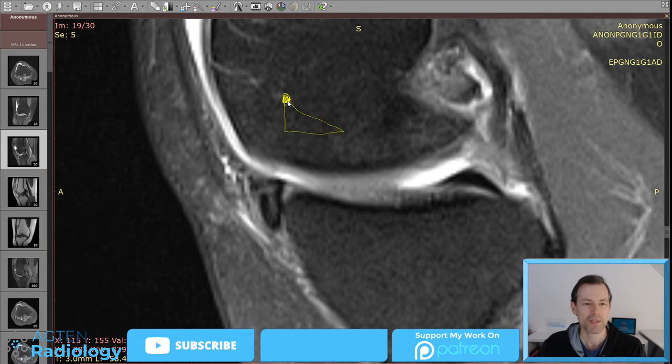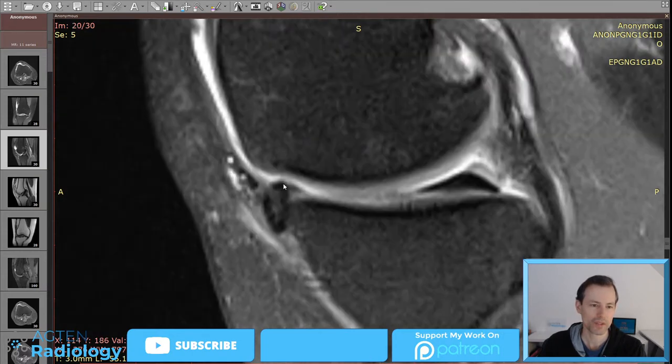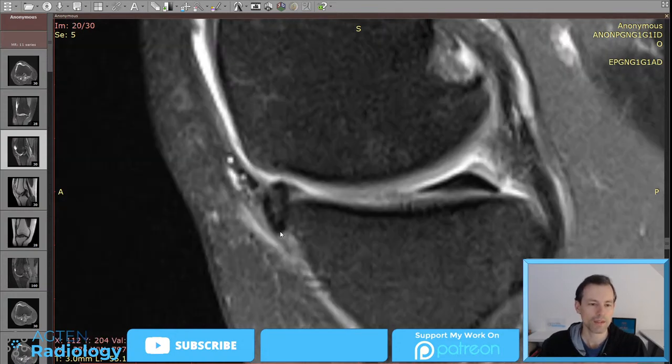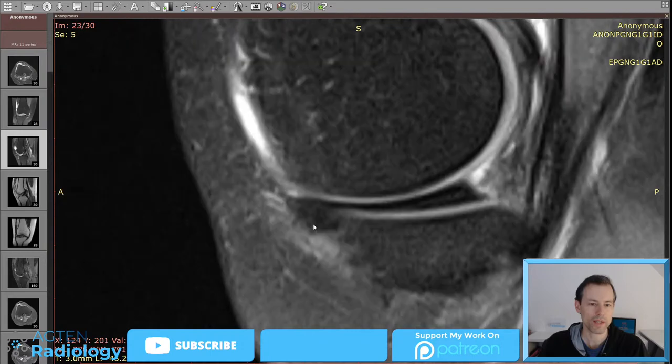Yeah, coming back to this one here. Look here. This is how it's supposed to be. And here, this kind of dot, if we go back, we can see the transverse ligament. It's inserting here. So what is actually happening? First of all, you can obviously see there is a tear. This is not normal signal, it's also not normal morphology, and it's just hanging over the edge here.